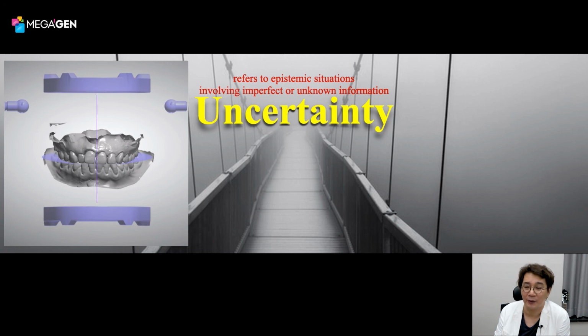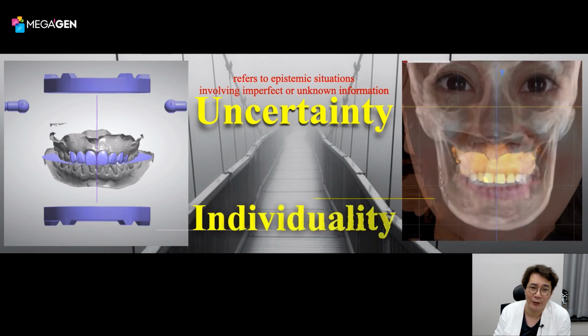Condyle position, center of the face, ideal occlusal plane, midlines. And based upon that, finally, our lab technician can make the prosthesis. At the time, all of the information should come from the patient, our individual patient information.